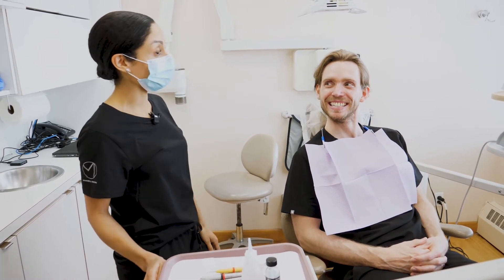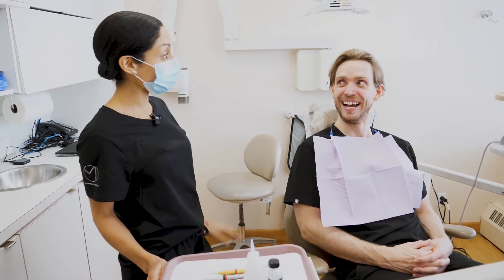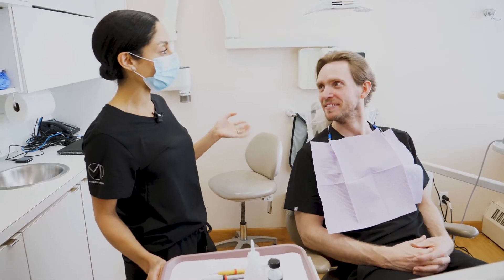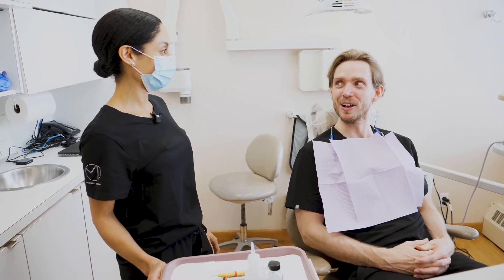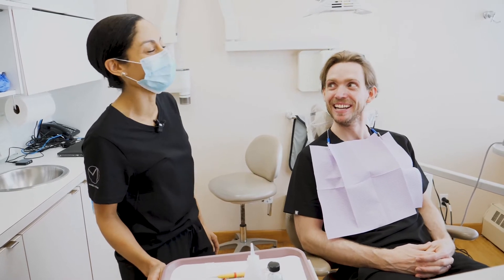So if I haven't flossed today... If you haven't flossed today, then we're going to see some bacteria in there for sure. If you have, we may not see much. But also we can tell which bacteria have been there for a short period of time versus a longer period of time — so if you're trying to sneak in some flossing before your cleaning to make it look real good.